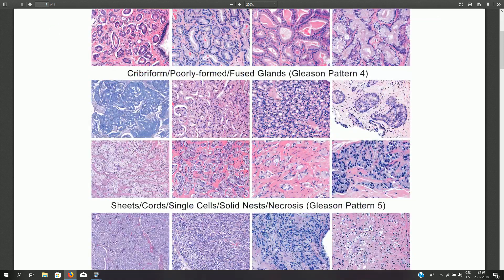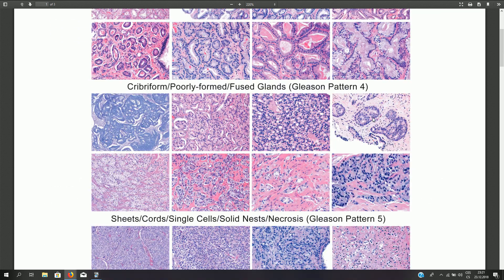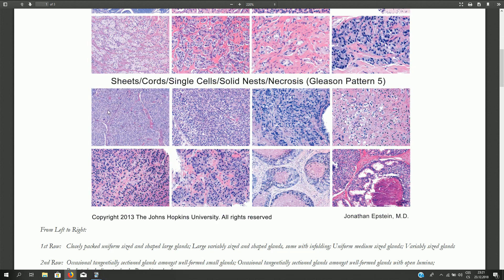Gleason pattern 4 is made of fused glands where we can still appreciate luminal formation but cannot encircle individual glands. Cribriform structures are also typical for Gleason pattern 4. Gleason pattern 5 is composed of solid nests without luminal or glandular formation; it also includes structures with very poorly formed lumina-like spaces that are actually just cytoplasmic vacuoles, not true lumina. Comedonecrosis, as in this example, is also Gleason pattern 5.